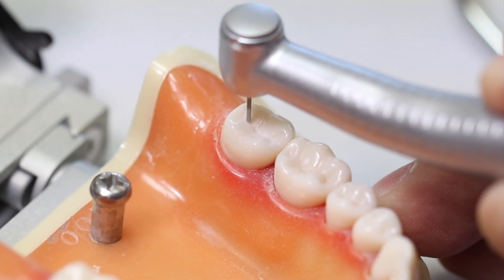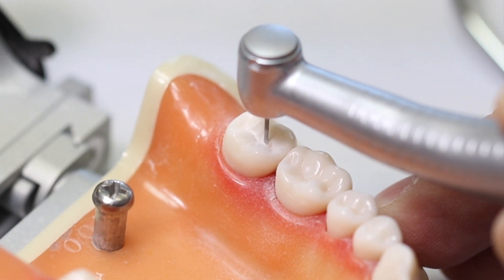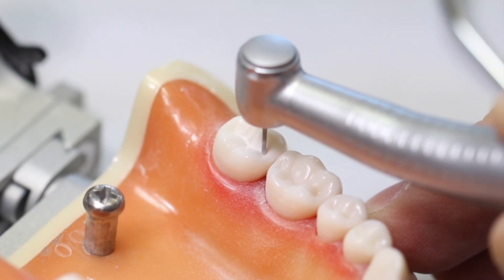Notice the groove isn't straight across, so follow the anatomy of the groove. Be sure to keep the burr parallel to the long axis of the tooth.